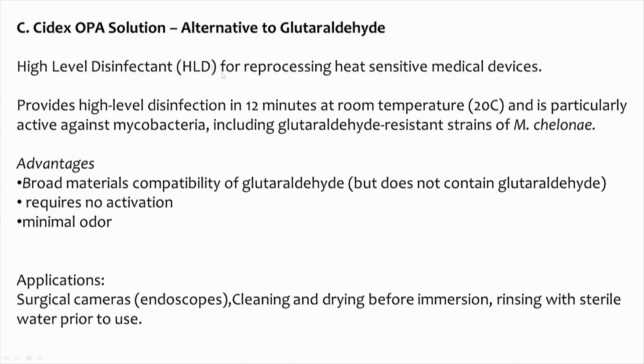Here you are using a high level disinfectant with broad materials compatibility, requires no activation, minimum odor. For surgical cameras, cleaning and drying before immersion, rinsing with sterile water prior to use, and so on. This is called a Cidex OPA solution, which contains a high level disinfectant.